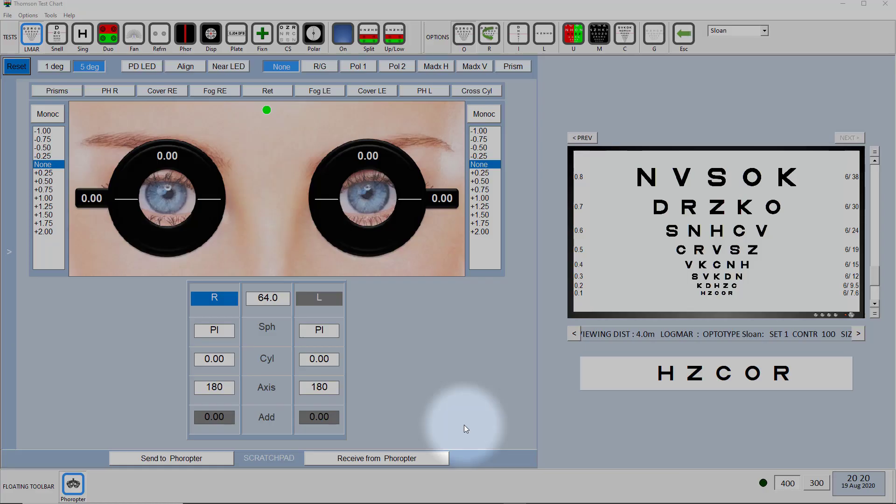In this video I'm going to show you how to use the scratch pad function of the Phoropter module and how you can use that to import a prescription from your patient management system and export a final prescription back into your patient management system.